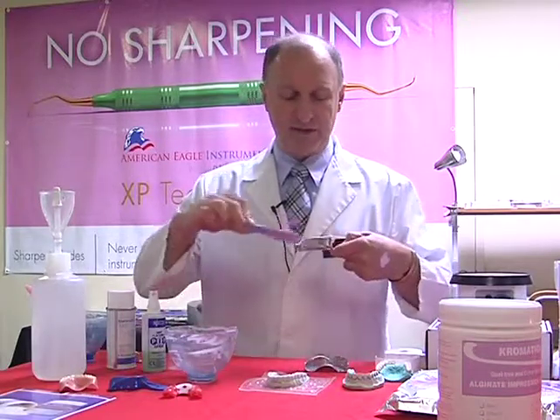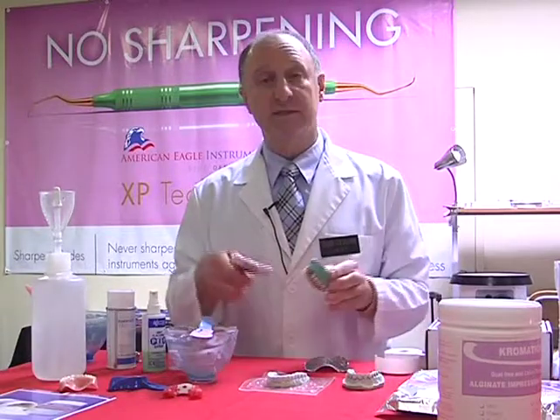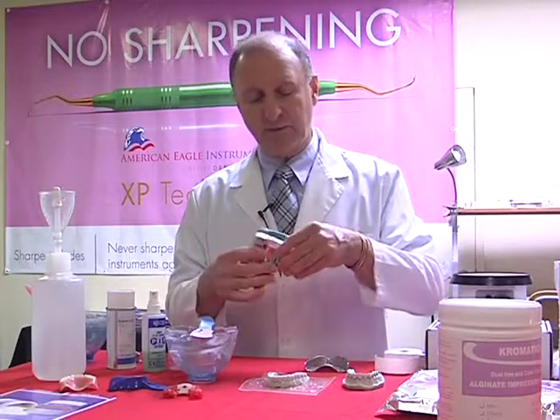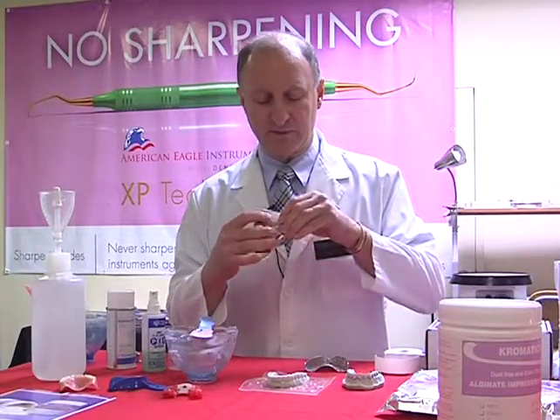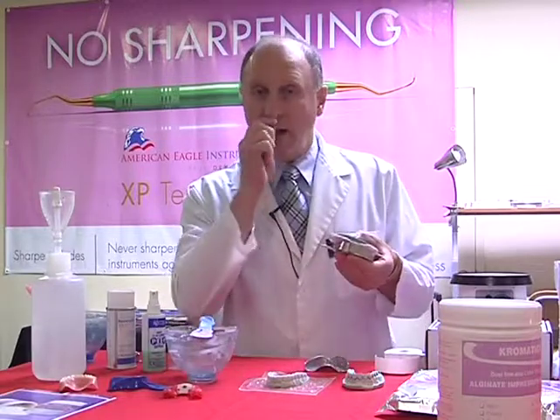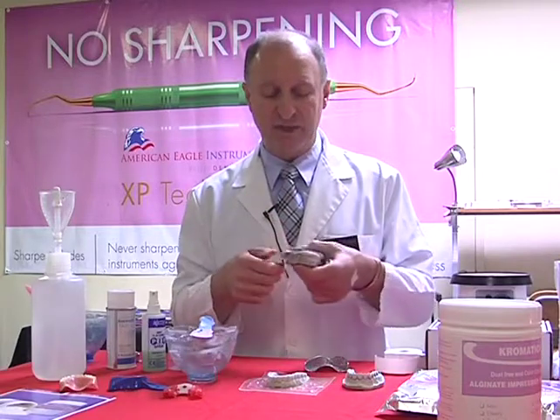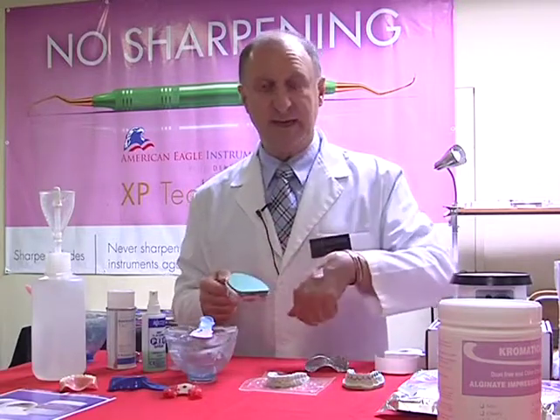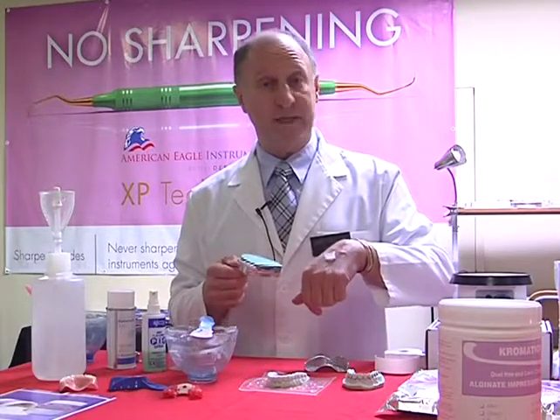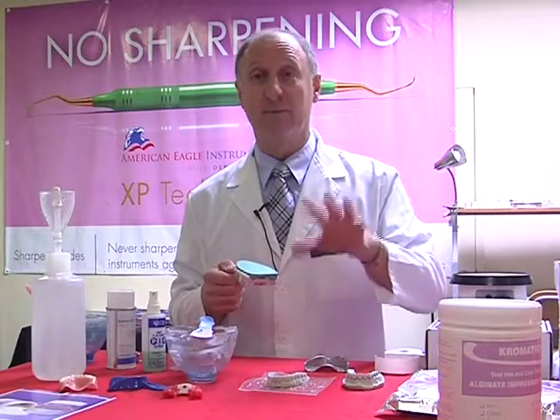So I'm packing my impression tray, and I'm now ready for our impression. So we're normally going into a wet mouth environment. As we go in, we apply a small amount of pressure, and normally I'll be pulling my lips down over and then muscle molding, getting a good functional impression. This material, as being a color change, as we can see, it changes from purple to pink to white.